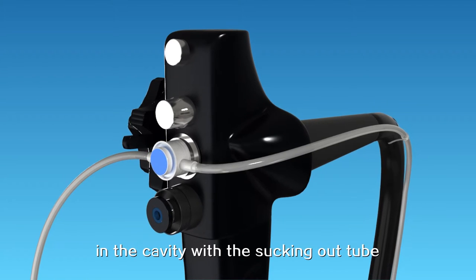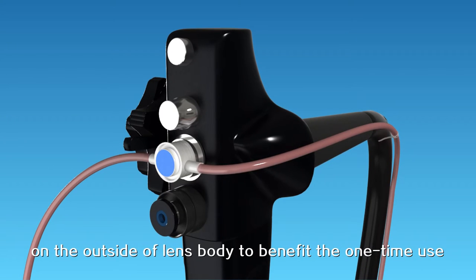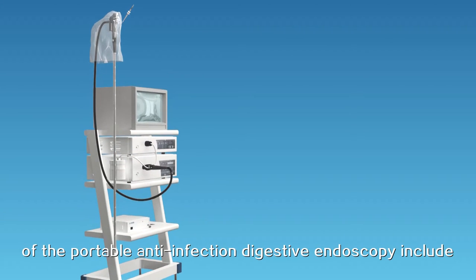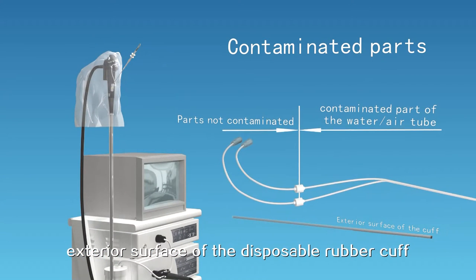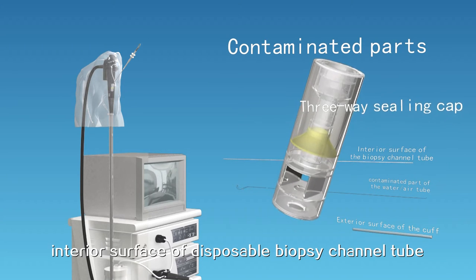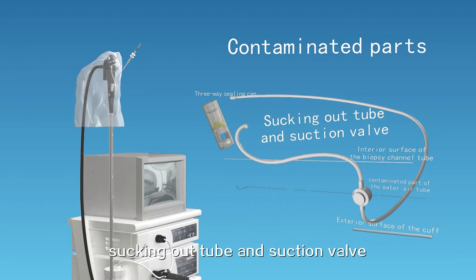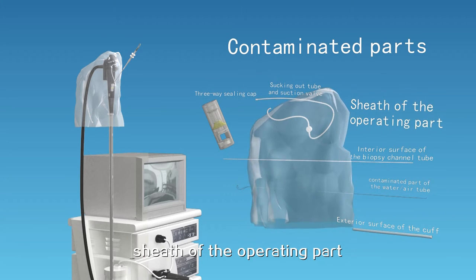Press the suction valve to suck out the fluid in the cavity with the sucking-out tube. Both the sucking-out tube and suction valve are on the outside of the lens body to benefit one-time use. The contaminated parts of the portable anti-infection digestive endoscopy include: the exterior surface of the disposable rubber cuff, part of the water-air tube, interior surface of the disposable biopsy channel tube, three-way sealing cap, sucking-out tube, suction valve, and sheath of the operating part.